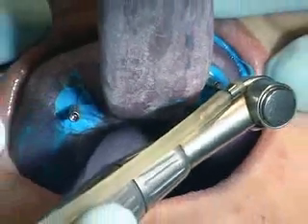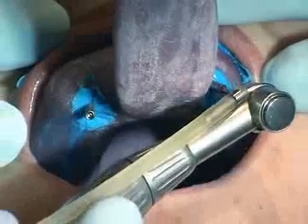Now the emergence apertures on the custom-made tray have to be checked. Then the impression can be taken using an elastomeric impression compound. This is the final impression with the impression caps.